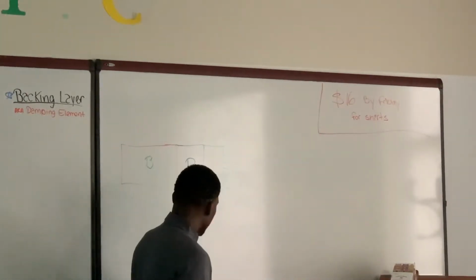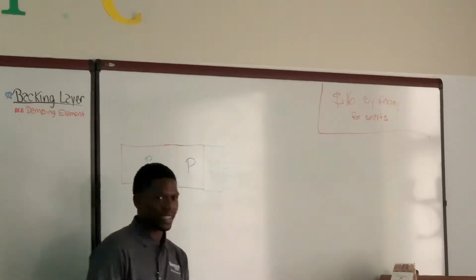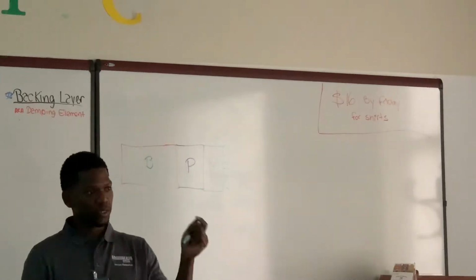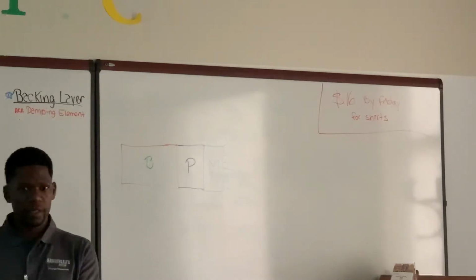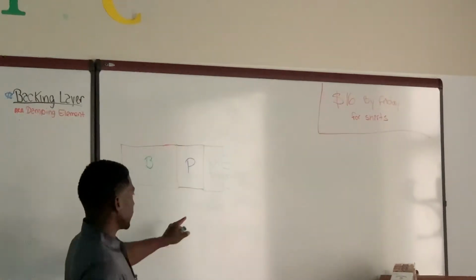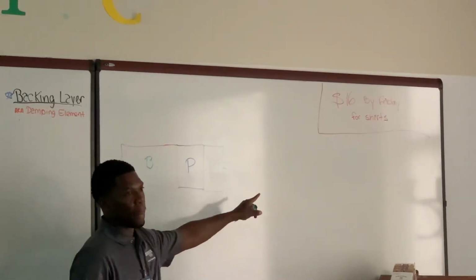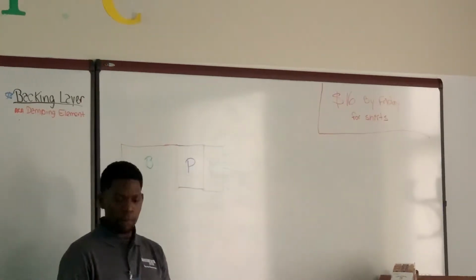And in the front, we have our matching layer, which helps us, I like to say, match the impedance differences between the PZT, the matching element, the gel, and the skin. Because really, it just helps us match the impedance difference between the PZT to the skin. But we also need the gel that's going to increase the transmission of sound.